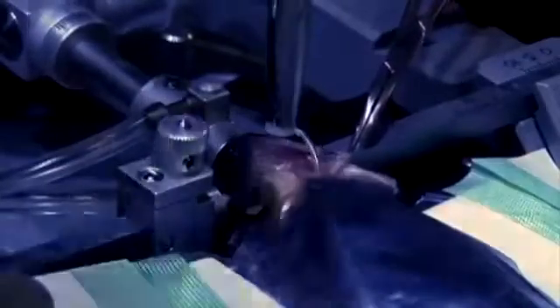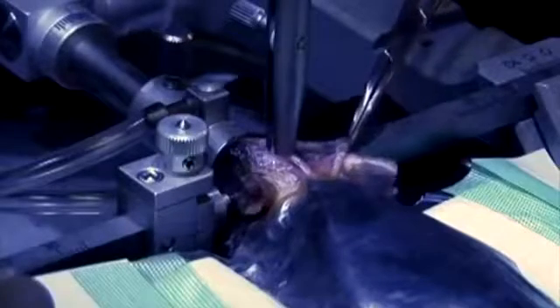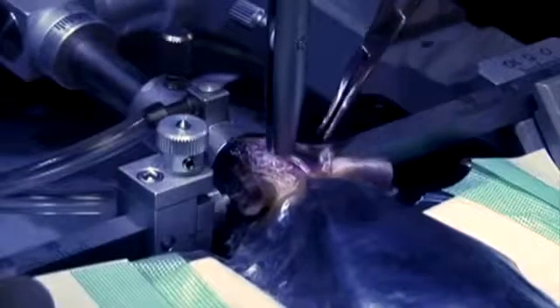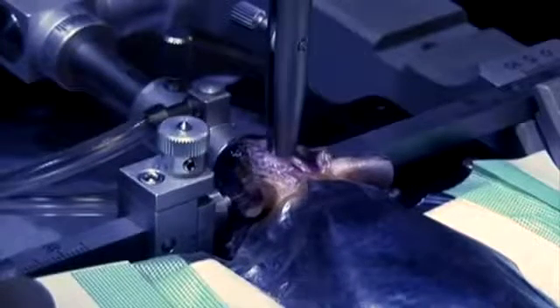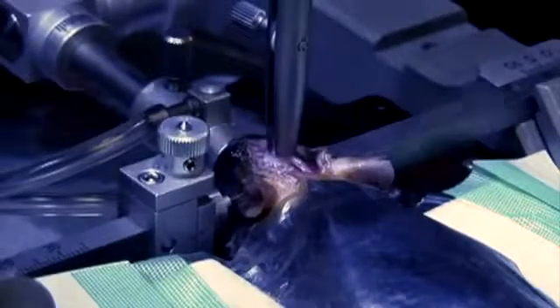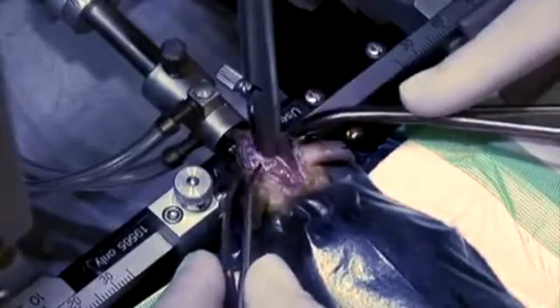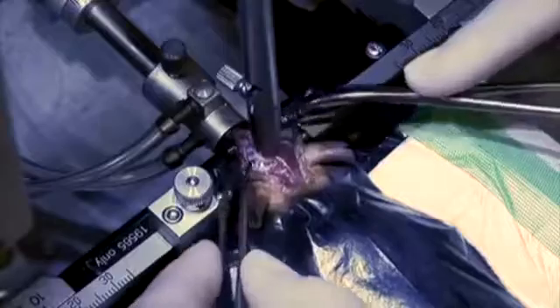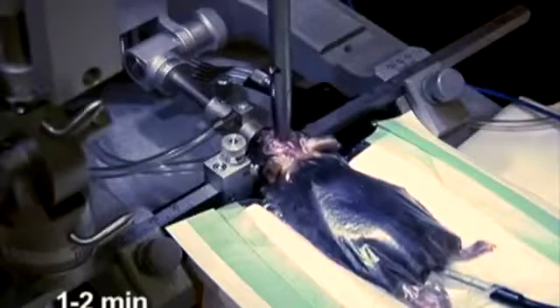Drive the catheter quickly through the skull until the cannula base is securely pressed against the skull. The catheter can be driven directly through the skull in mice due to the relatively thin skull. Pull any skin that has glue on it away from the skull. Then, with the cannula driver holding the cannula in place, wait 1-2 minutes for the glue to fully dry.